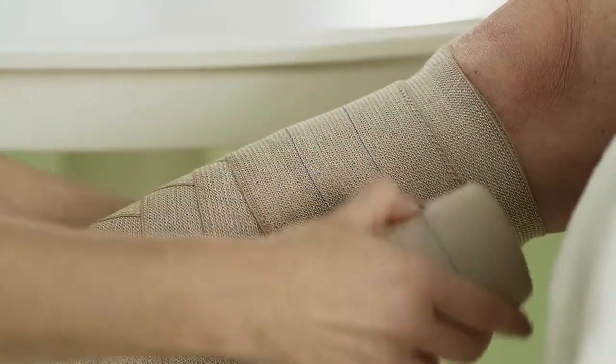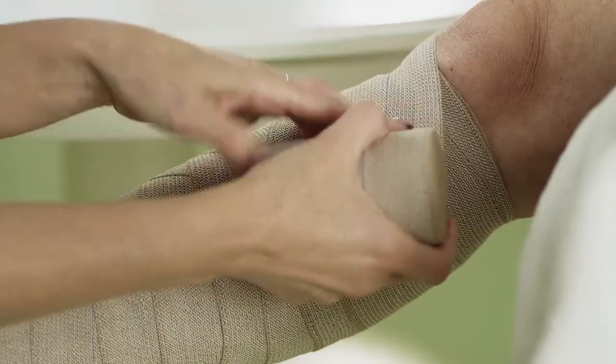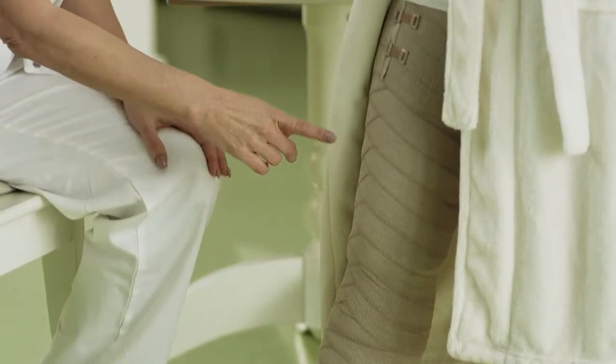When wrapping up to the groin, we start with the next bandage under the knee where we finished with the previous bandage, then we bend the knee and continue wrapping upwards to the groin.